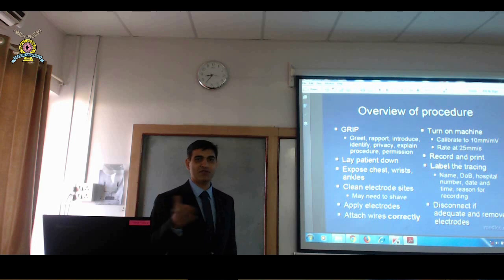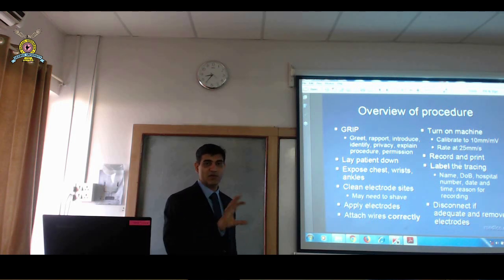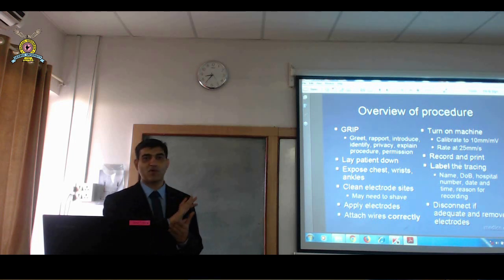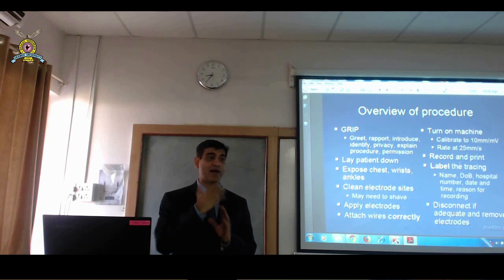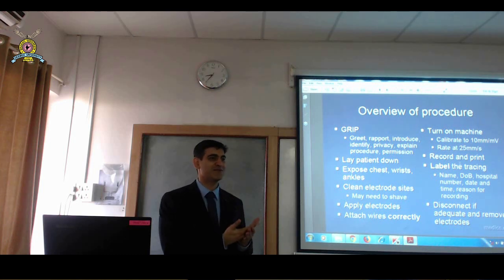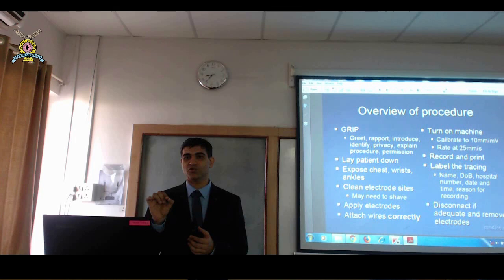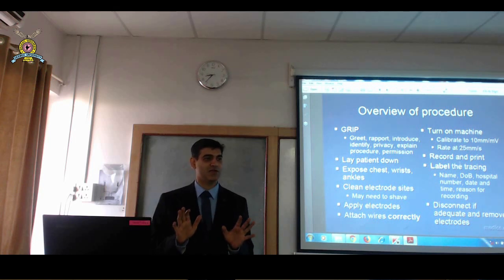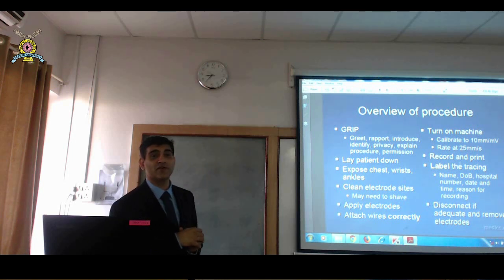Basic things, right? You will see how many ECGs you will find that have no date and time. I noted that many physicians here have some form of cardboard on which they stick the ECG, and on the back of that they write date and time. Is that good? No, you may have stuck it on a wrong patient's board. Then it is useless. What you need to do is write on the ECG itself, date and time, so that it cannot be changed at all. So write on the ECG: name, date, time, and reason for recording.